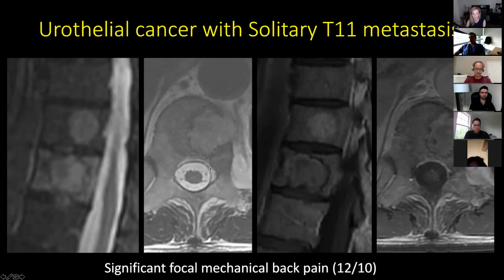I just want to bring your attention to one thing here. What you are seeing here is really what looks like the tumor edge, as you can see here on the post-contrast image. But really, you can see some changes in the bone that are extending beyond the edges of the tumor. And that's something that I have learned from my radiation oncology colleagues.